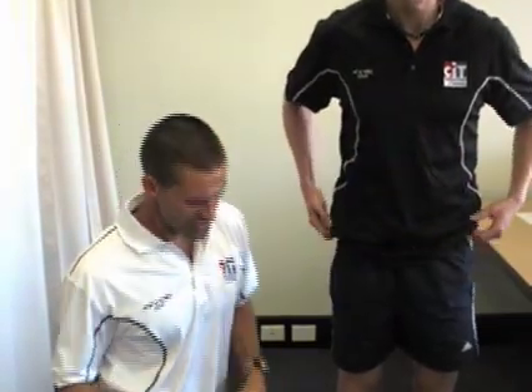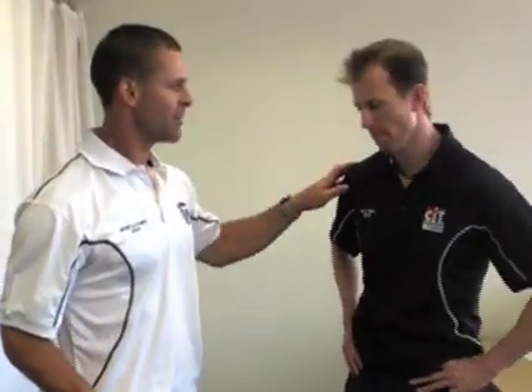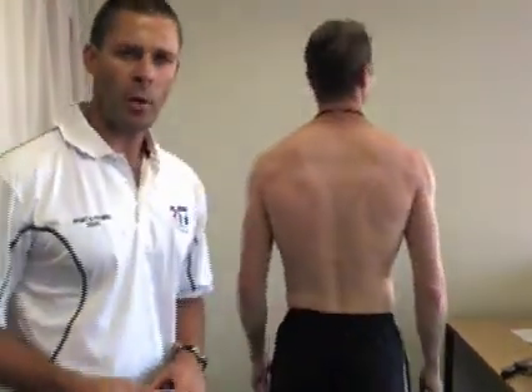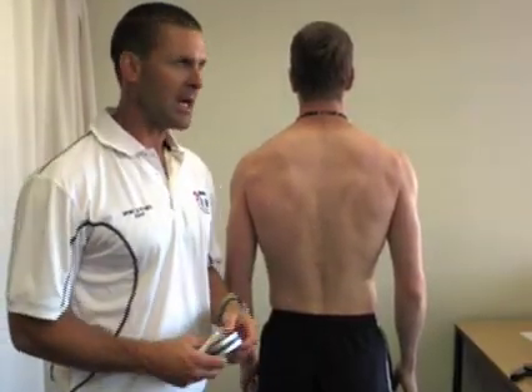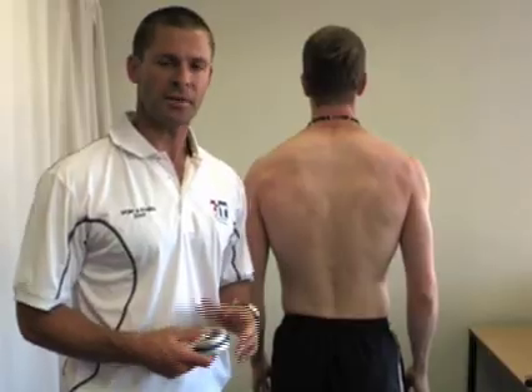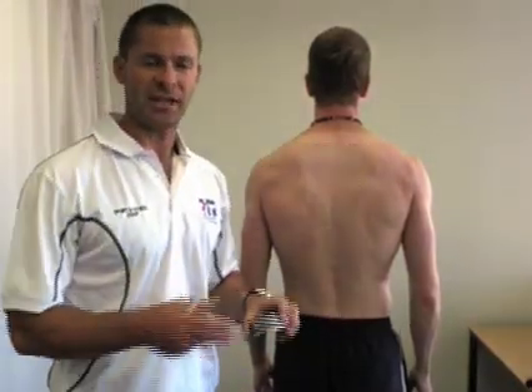The next one we're going to do is the subscapular. The subscapular skinfold is on the back of the client, so we'll get Simon to take his shirt off. Keep in mind that for most clients it's very unlikely you'll ask them to remove their shirt — you can simply raise the shirt up, find the site, and take the measurement.